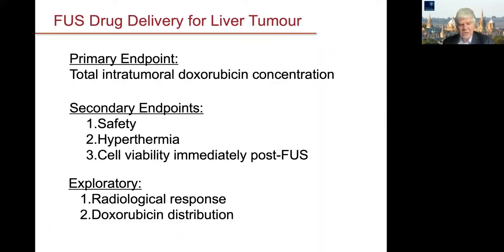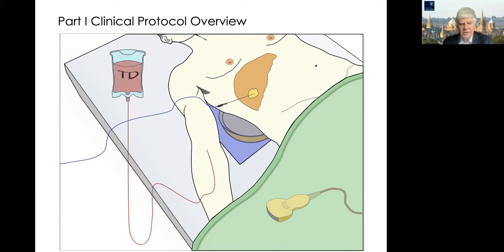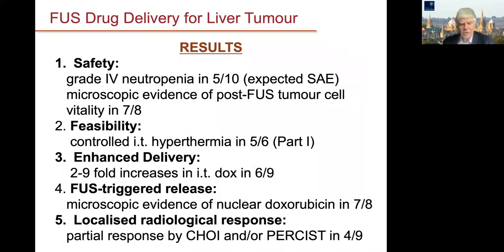And a colleague, Konstantin Kousios, and my colleague Paul Lyon were doing this work. He did it for his PhD thesis. And so what they were doing was that they were biopsying the tumor to start with, and then measuring it, they were measuring the temperature of it, putting THERMODOX into the peripheral circulation, and then heating up the tumor. And then as the drug passed through, it broke open and you got targeted drug delivery. So you got enhanced delivery, 2 to 9-fold increase in the tumor, and got a good response.